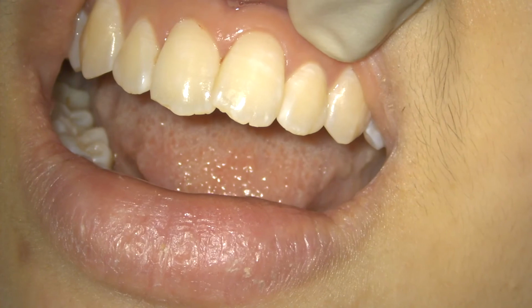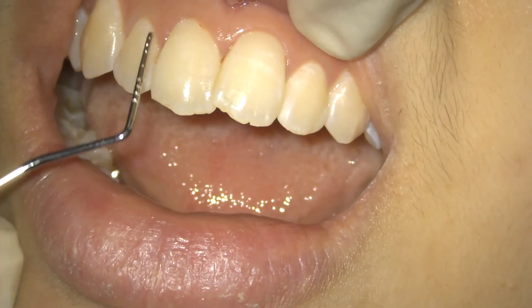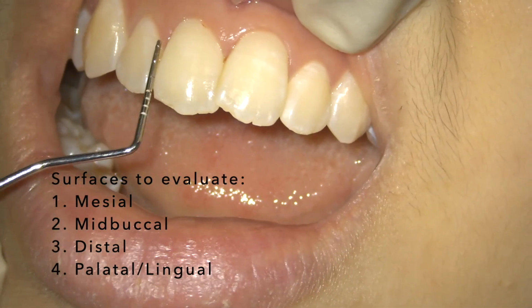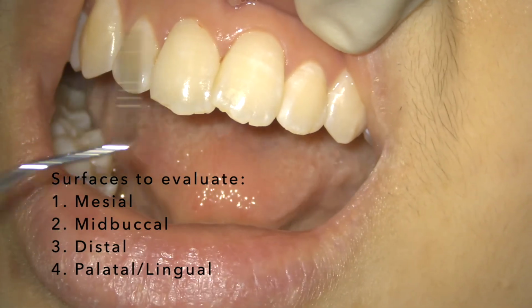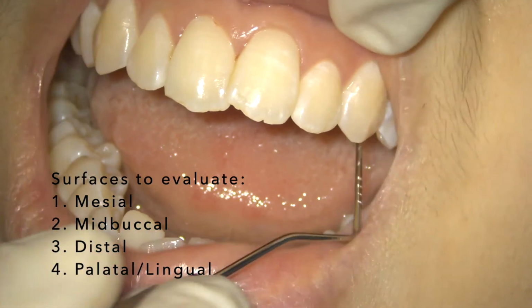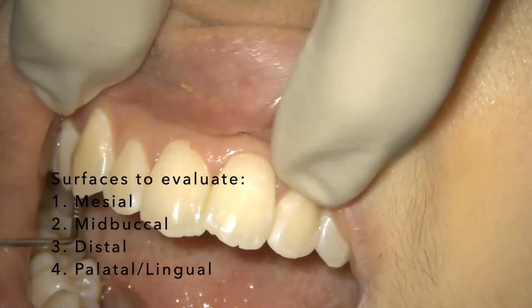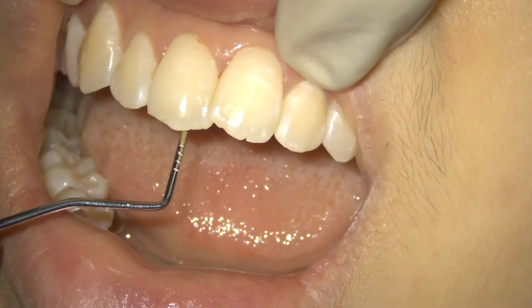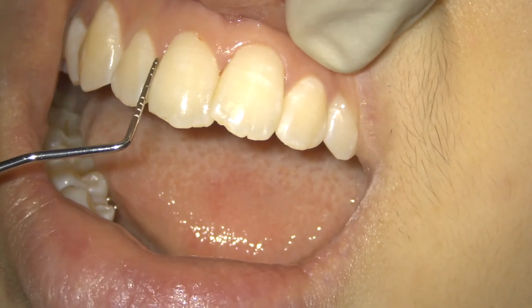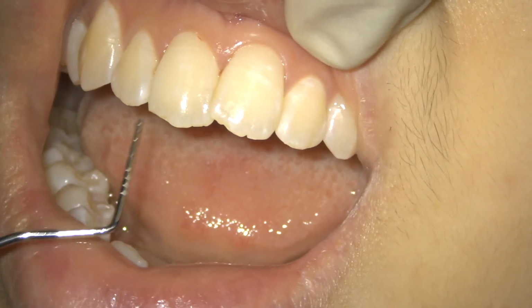Now, which surfaces should we evaluate? On the buccal or the facial aspect, you will evaluate 3 surfaces: mesial, mid-buccal, and distal. Once you finish probing all the facial surfaces, you go continuously onto the palatal surface. You run the probe palatally like this and come back to the distalmost point where you started. Palatally it is only the mid-palatal surface. So the total is 4 surfaces. Distal, mid-buccal, mesial, and palatal.